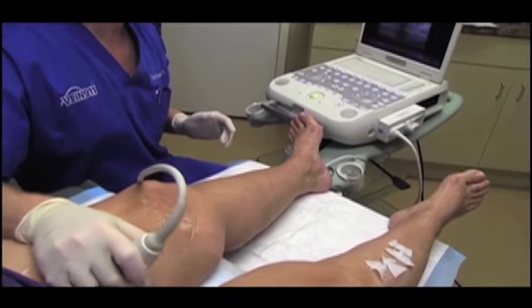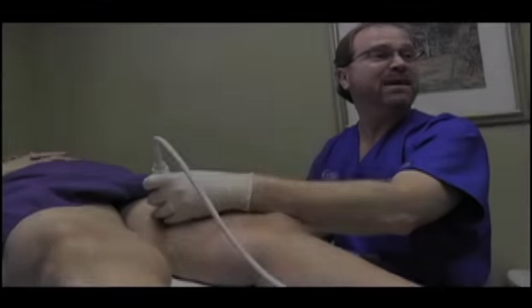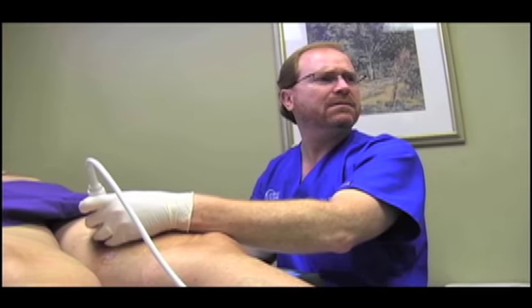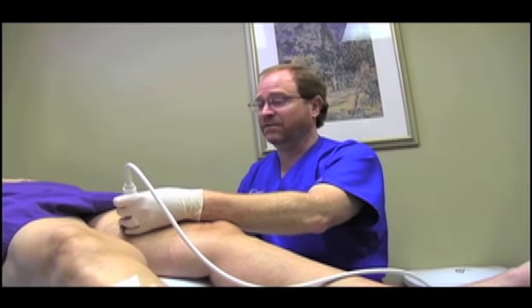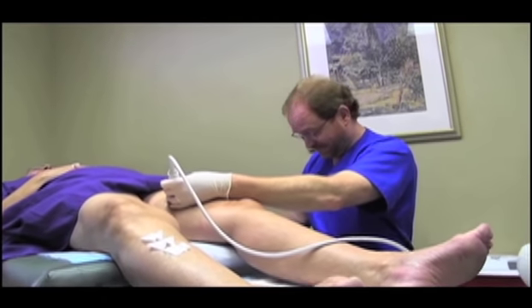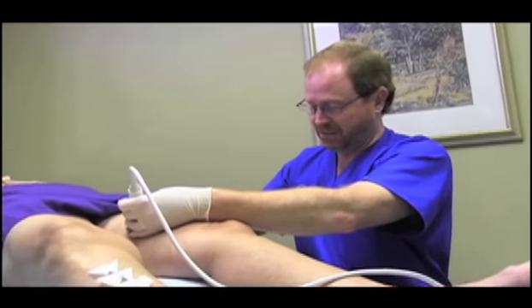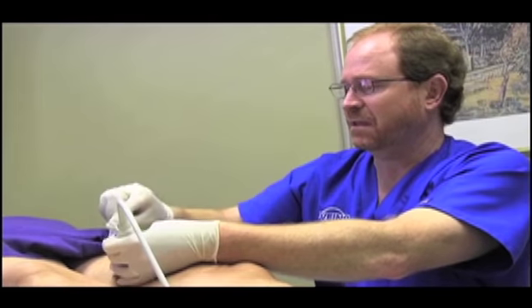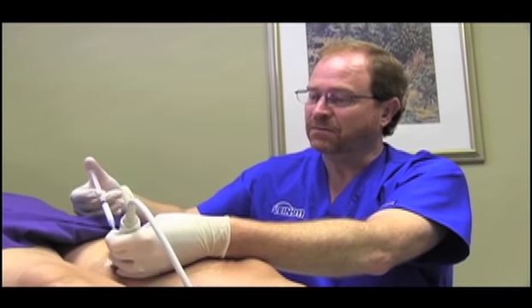So I want to go from the top of the leg to the bottom — I want to get rid of that leak in the attic that's causing the flood in the basement. We're going to inject these veins up here. Some patients can sing in here. People think that sclerotherapy is a painful thing, but it's just not. For spider veins it's a needle literally the size of a hair shaft, and we've never had anybody cuss or leave.